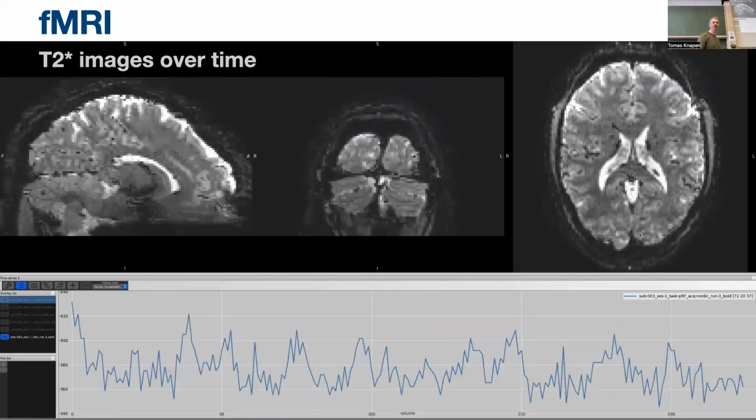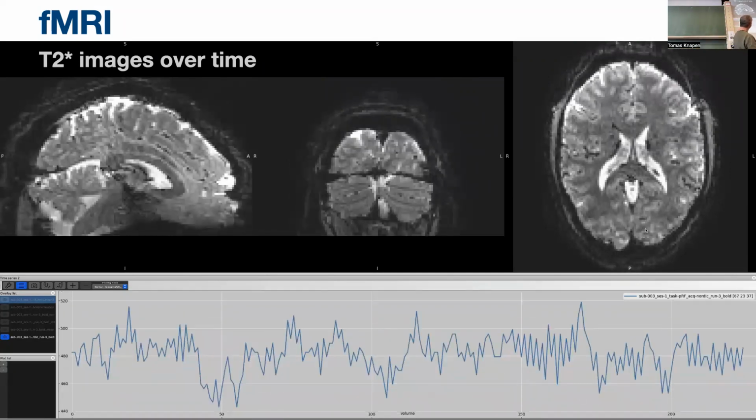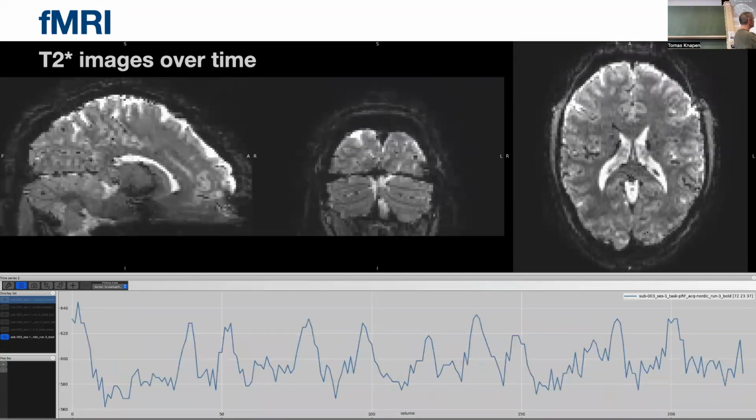And so that means that we can now start to relate the brain activations that we're measuring, such as these. These are the signal that we're interested in. We knew that we're presenting something here and here and here and here. We want to be able to say, this happened in the experiment, now I expect this sort of signal to transpire in the brain. So that is the signature of the response that I'm going to be looking for.